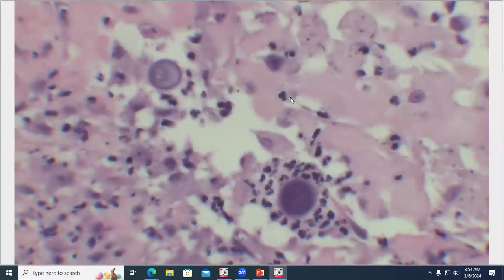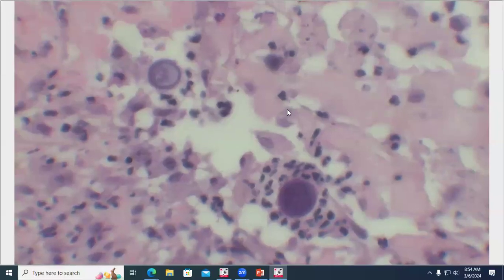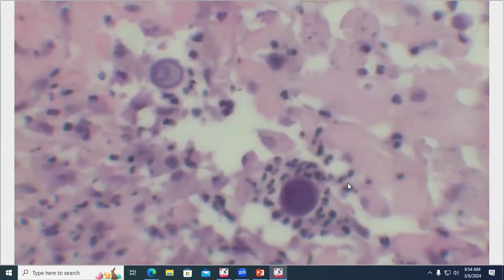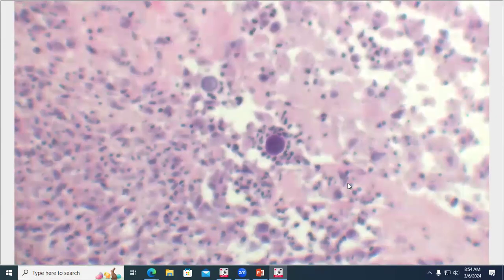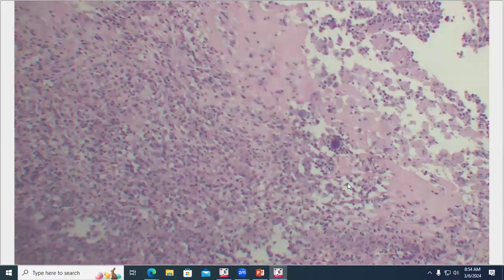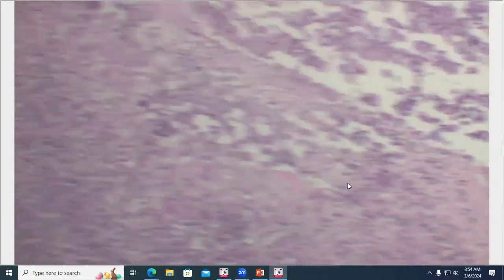We can see that they are fungal friends again, but a different fungal friend this time. So they have a wall and sort of flocculent basophilic contents. Let's see, it's called like a biconcave wall fruit. For some reason, the term is escaping me. It's not biconcave, it's something else. But these are fungal spherules is the appropriate term for these guys.